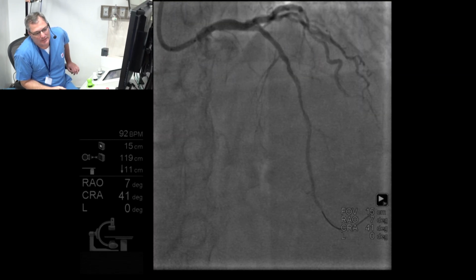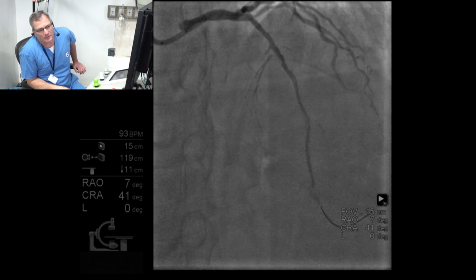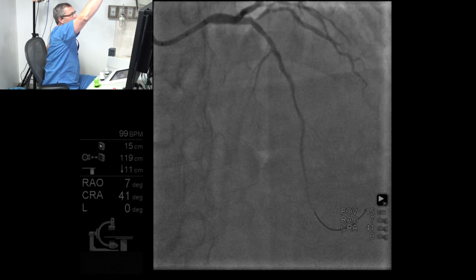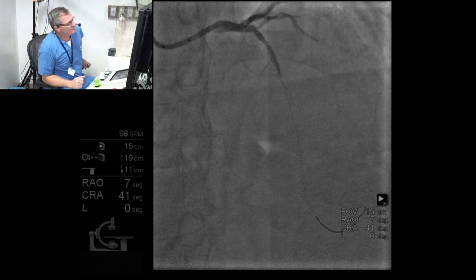Can you answer a couple of stent questions for us? Yeah. Can you use a 7 French guide, just for education, with this setup, or does it have to be a 6 French guide? It's compatible with 5 through 7. On label, off label, I do a lot of 8 French CTO work, and it still works with an 8 French guide. And if you knew you were going to have problems at baseline, can you preload with a guideliner and still work?